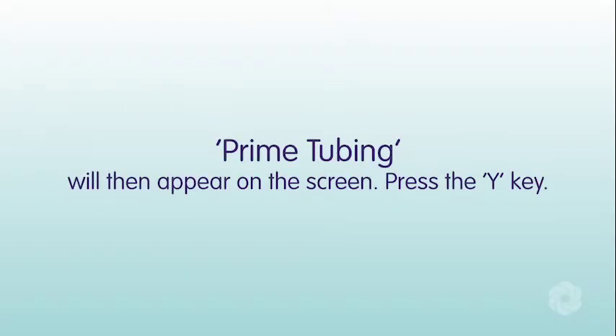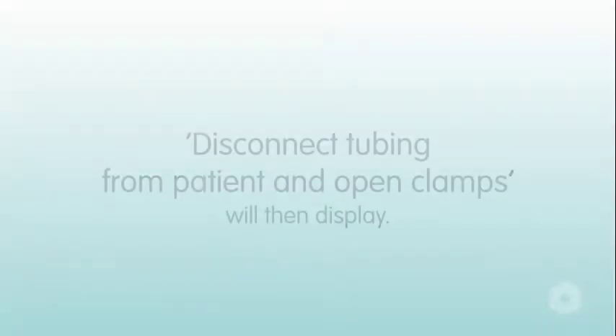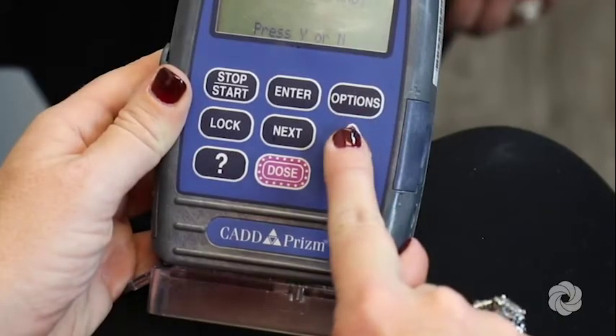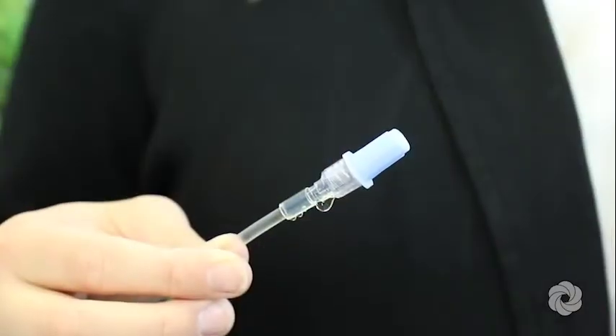'Prime tubing' will then appear on the screen. Press the Y key. 'Disconnect tubing from patient and open clamps' will then display. Press and hold the Y key until fluid drips from the end of the tubing.